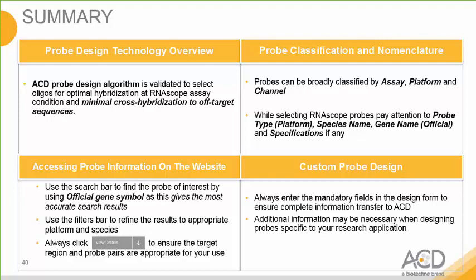For probe classification and nomenclature, our probes can broadly be classified by assay, platform, and channel. While selecting RNAscope probes, please pay special attention to the probe type, which is your platform, the species name, the gene name, we use the official NCBI gene name, and specifications, if any.